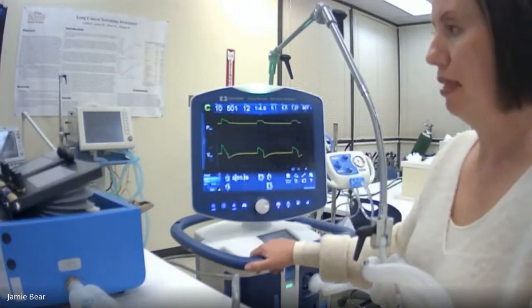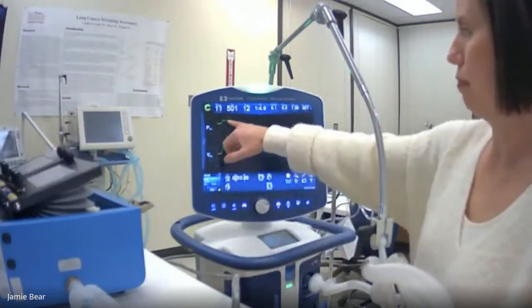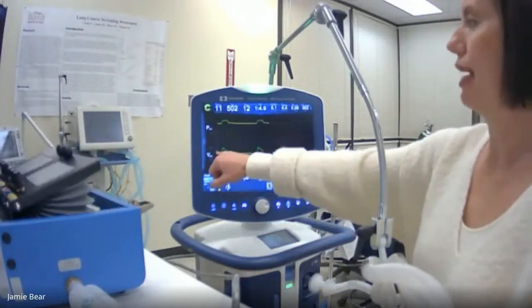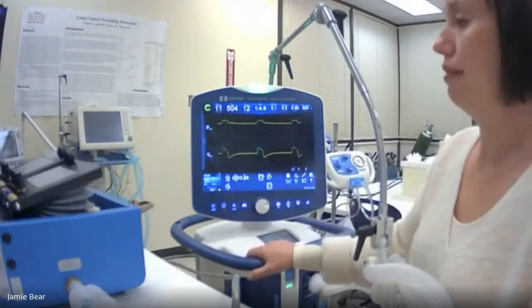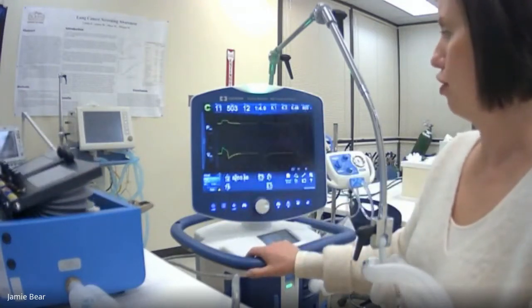Okay, so it had to do a couple of test breaths, and now look how that pressure drops. Okay, so now we go back into that decelerating flow waveform. Here's our pressure scaler again, and it looks great. Everything's nice and even. Patient's accepting breaths. There's no trigger.